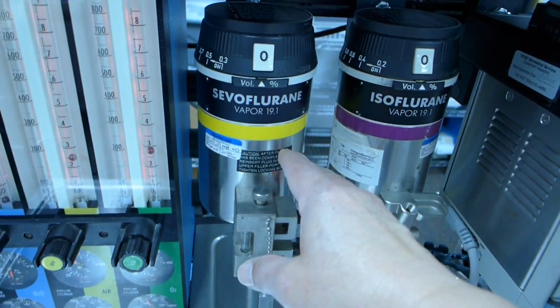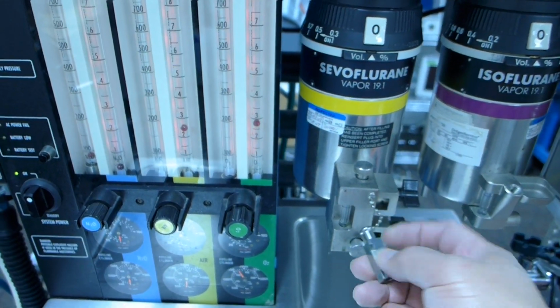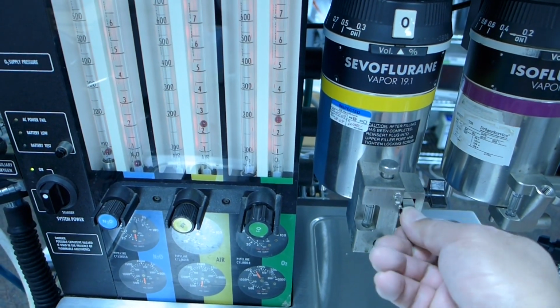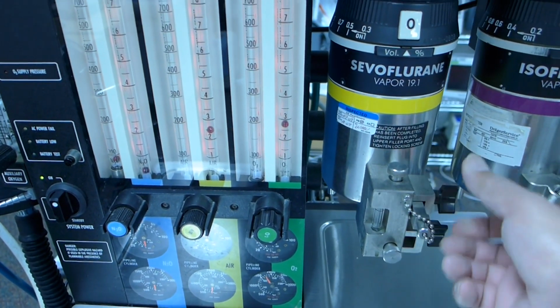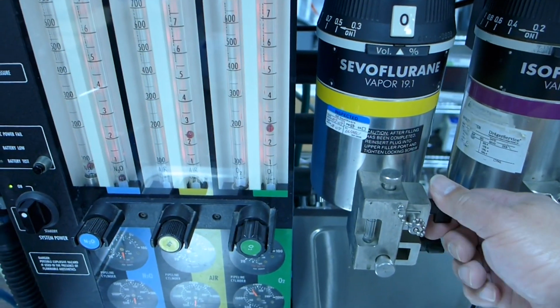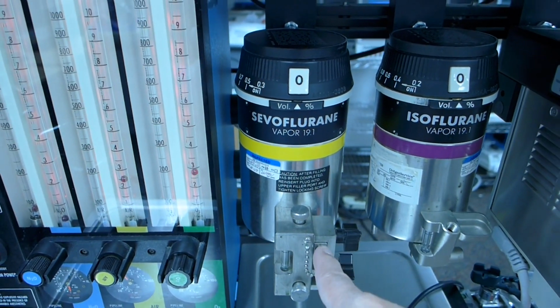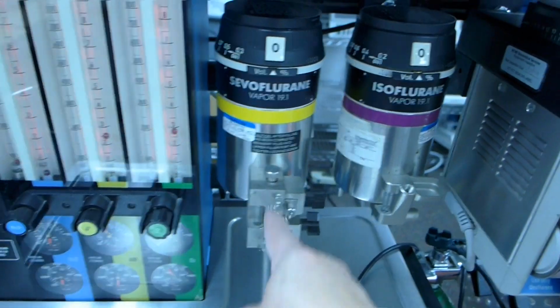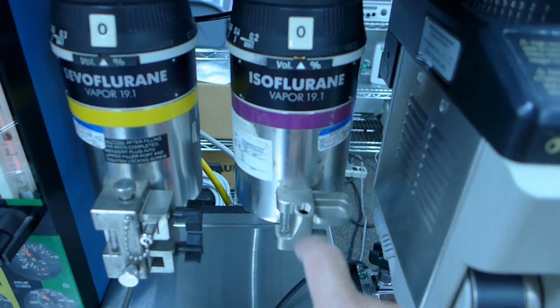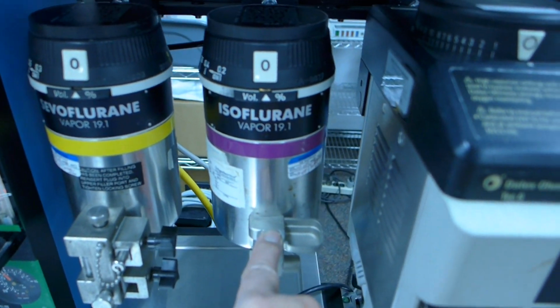To the right hand side is a Sevoflurane vaporizer. You can actually fill this thing. Oh, we need to put this thing in. This is just to prevent somebody from filling the wrong vaporizer in there. So each vaporizer has different configurations. Apparently this one we can't really use because the plug is missing.